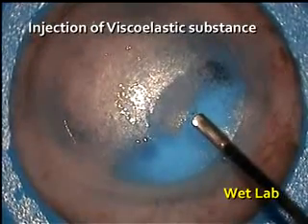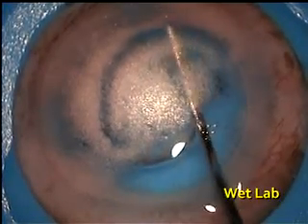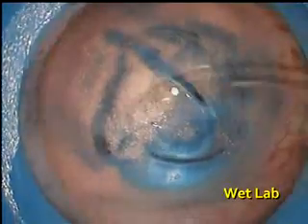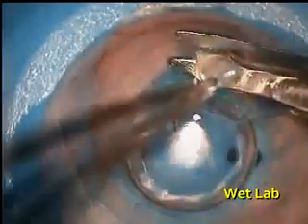Viscoelastic substance injected. Descemet separated from rest of the stroma. Rest of the surgical steps are similar to routine DALK procedure.